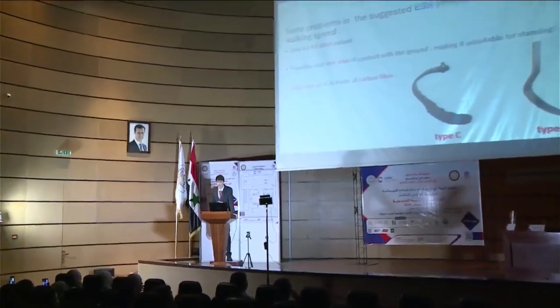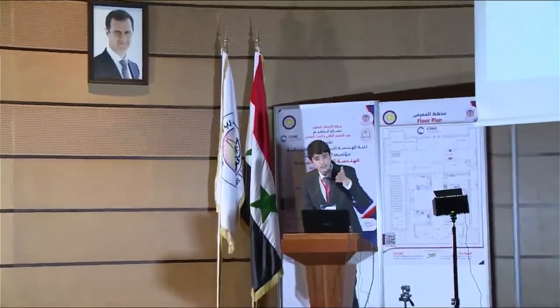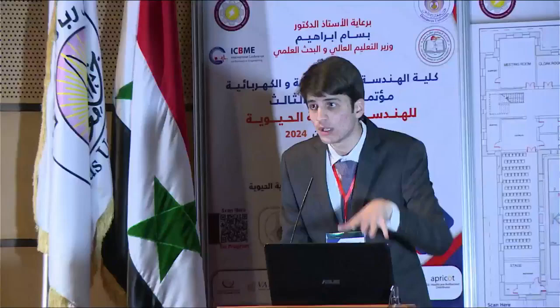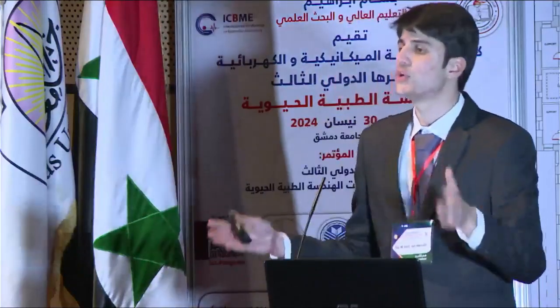Researchers found some problems in the suggested ESR prosthetics. The main problem is that it is only for K4 level patients, while we are focusing on the K2, K3, and K4 levels in our study. It provides only one area to contact the ground, and it's high cost because it is made from carbon fiber. So the aim of our research is to simulate the mechanical static analysis to design a multi-keel sport prosthetic foot manufactured from different materials to reduce the cost. We are focusing on reducing the cost because we are considered a low-income country, and this is the most significant idea to be mentioned.